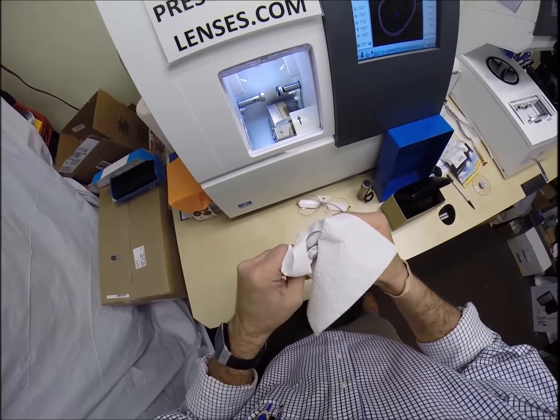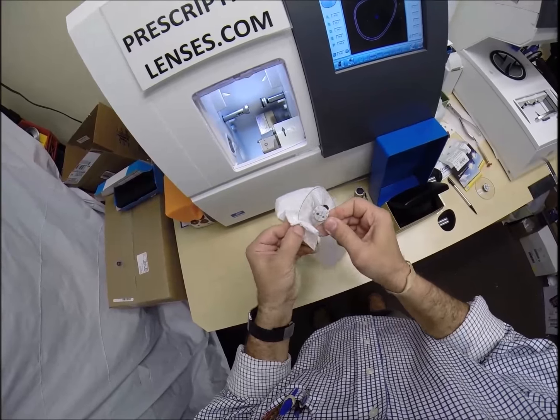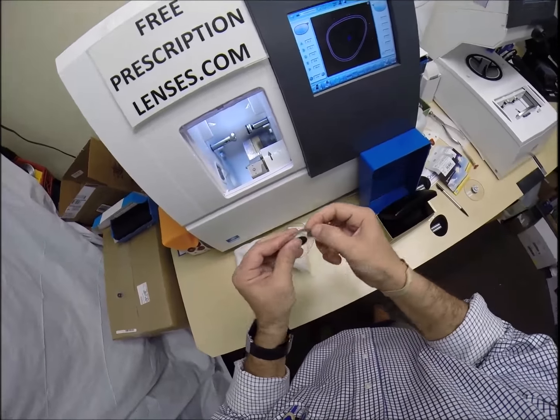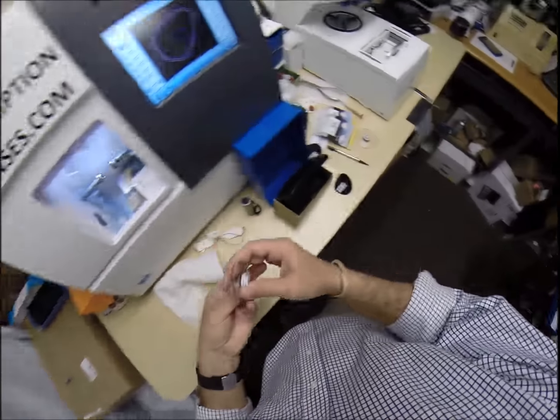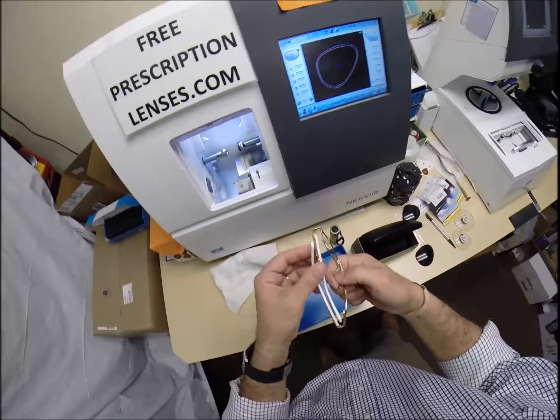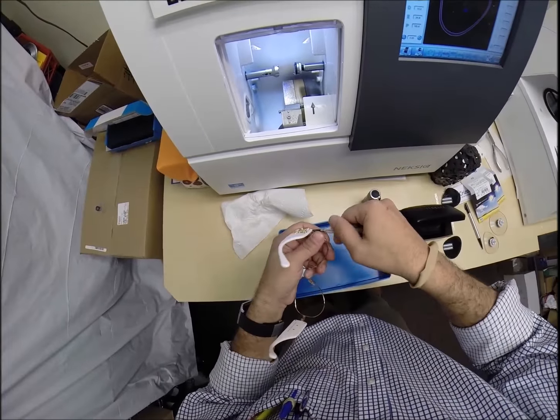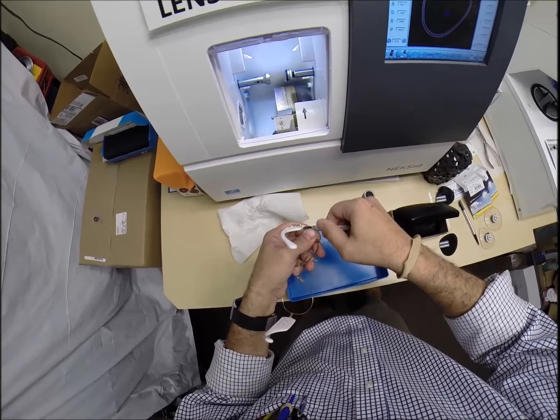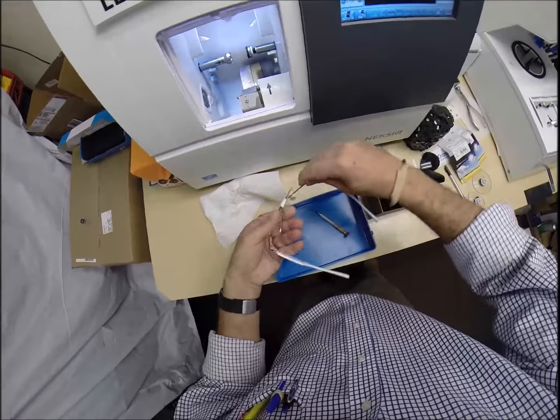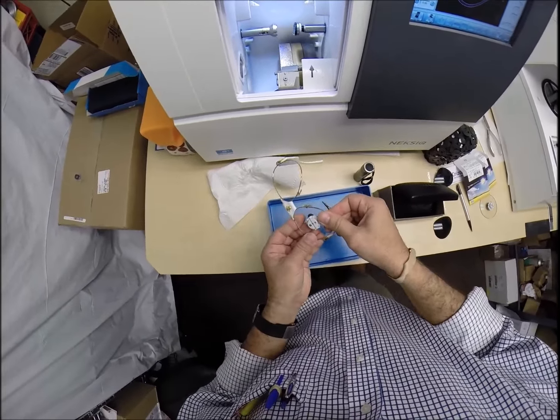So I'm going to dry the lens off. See something I want to clean there. Run my thumbnail around the edge of the lens. Now I have a tray here for this time because I need my Phillips head screwdriver. I'm going to go lefty-loosey to loosen the eye wire screw, hopefully not taking it out all the way, and then I'm going to pop your unbreakable lens into the frame.